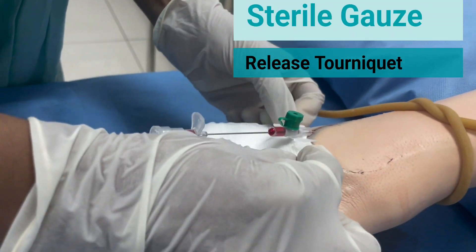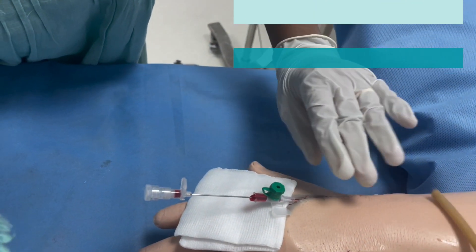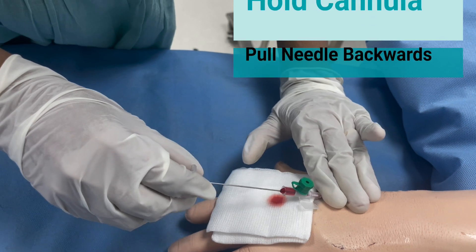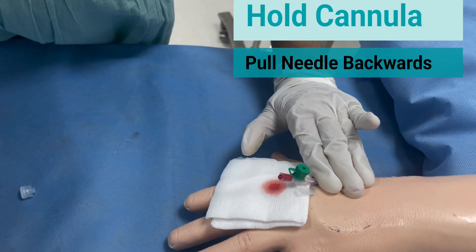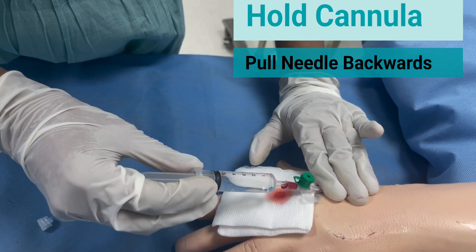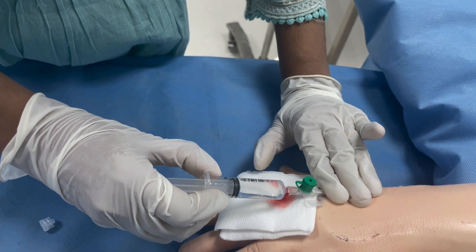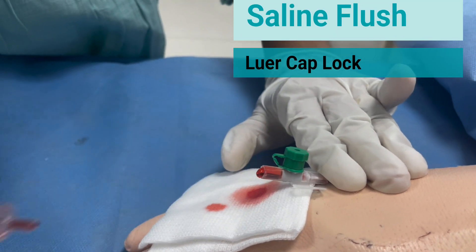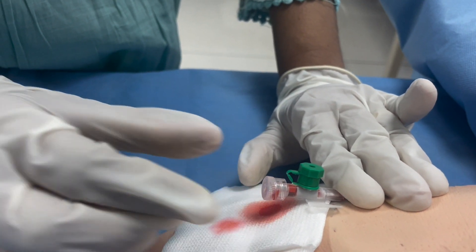Once that is done, keep a sterile gauze beneath the cannula set. Secure the cannula and completely remove the introducer needle. The saline flush that was prepared needs to be now injected into the cannula to keep it patent. Use the luer cap to lock the site.